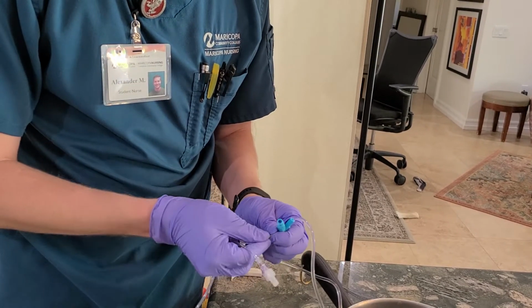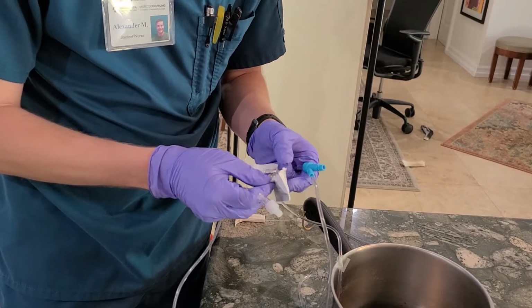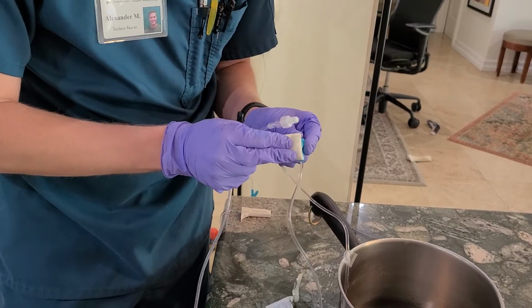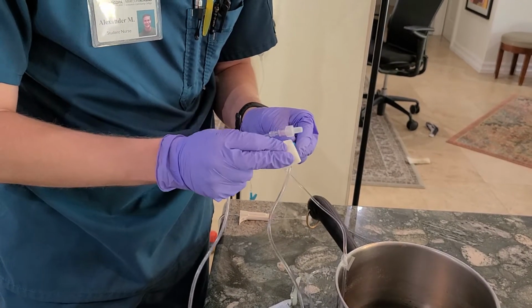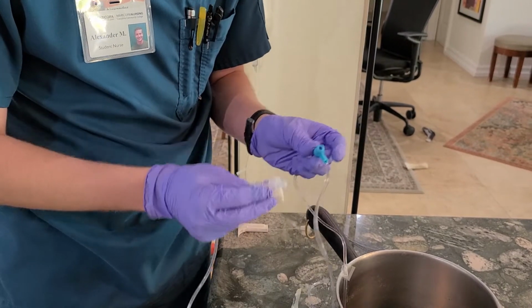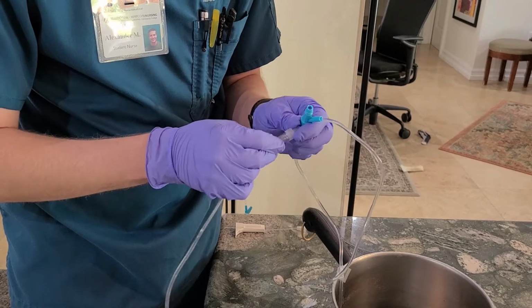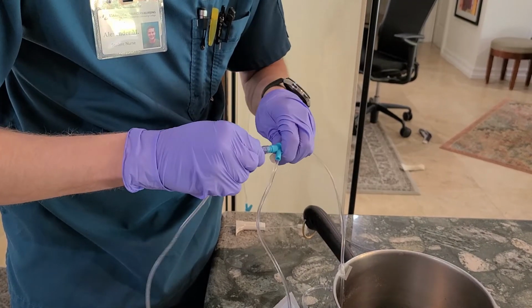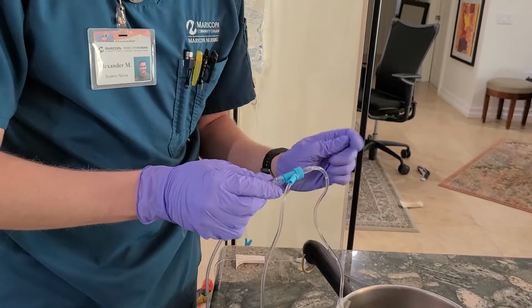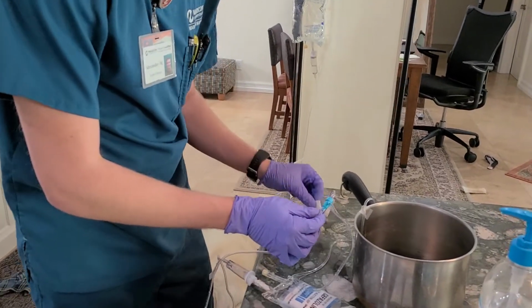Okay. I'll grab the alcohol prep pad. I'm going to clean for 30 seconds. Okay, it's been 30 seconds. So now I'm going to attach the port. Okay. Now that it is attached, I'm going to back prime.